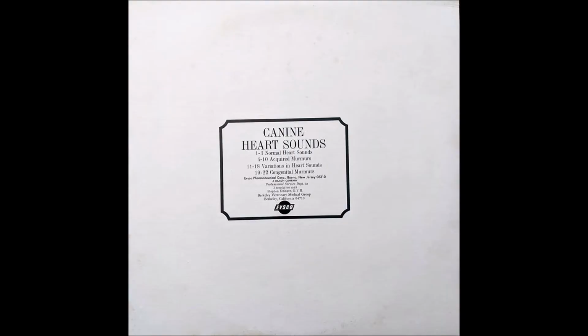The sound just played represents the mixed frequency murmur of mitral insufficiency that is auscultated at the left caudal sternal border. The murmur, which begins early in systole, increases in duration as the condition progresses. The intensity also increases with the severity of the condition and is often so loud that it is accompanied by a palpable precordial vibration or thrill.